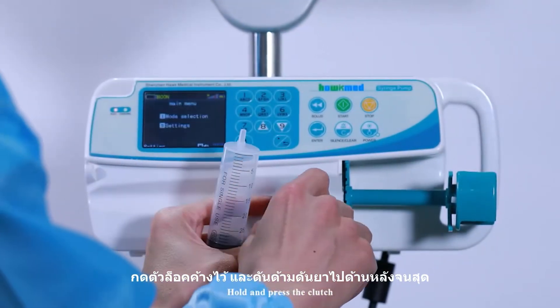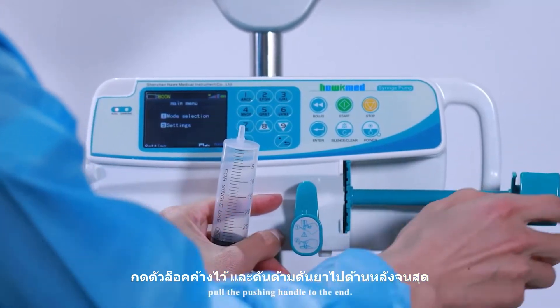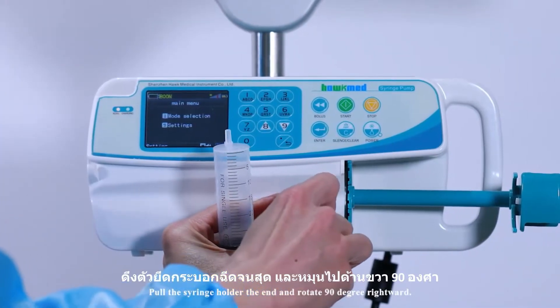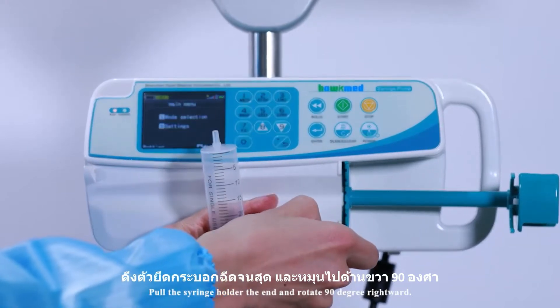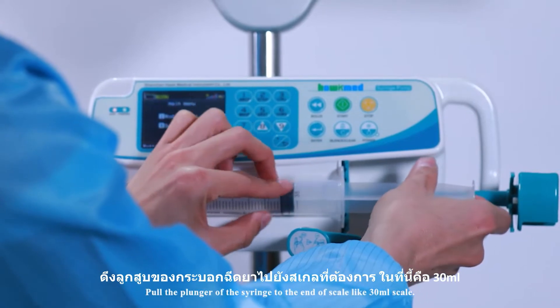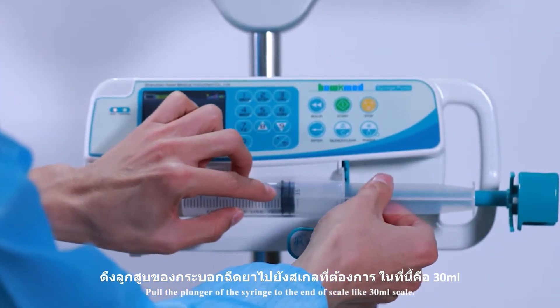Hold and press the clutch. Pull the pushing handle to the end. Pull the syringe holder to the end and rotate 90 degrees rightward. Then pull the plunger of the syringe to the end of the scale, at the 30ml mark.